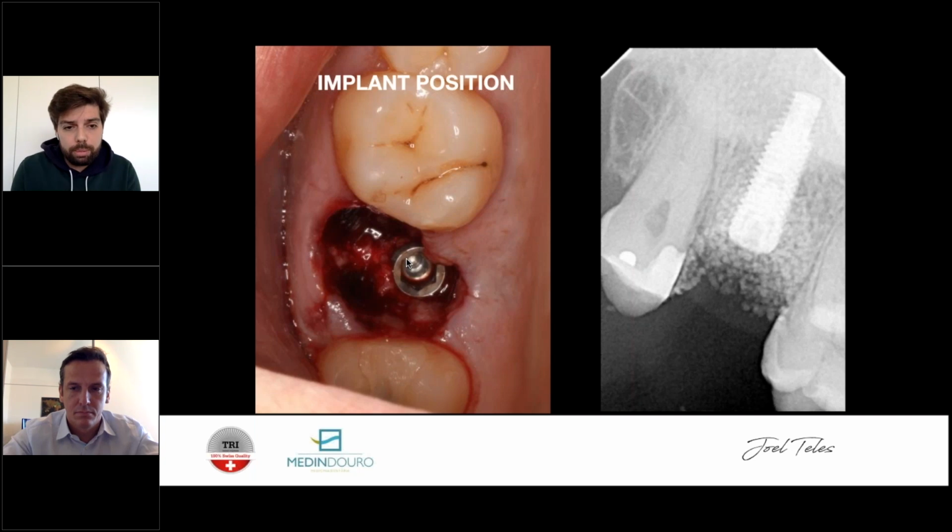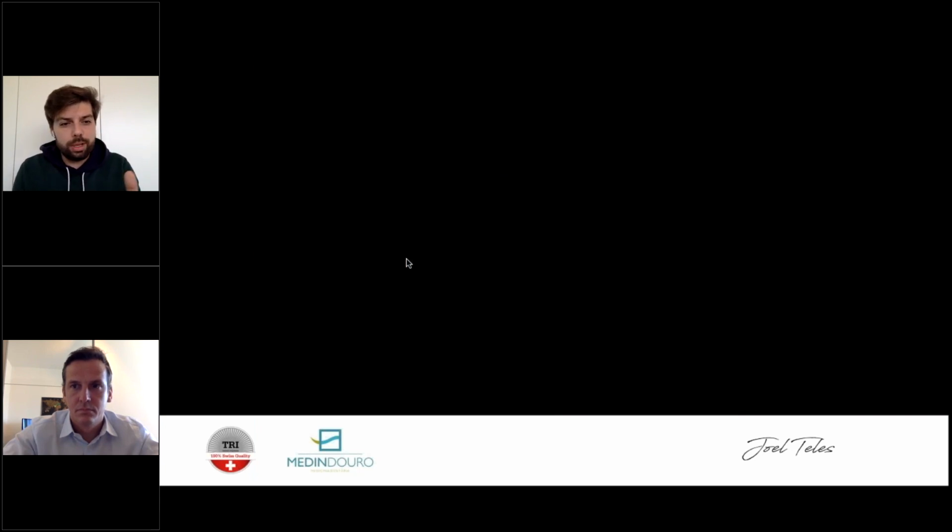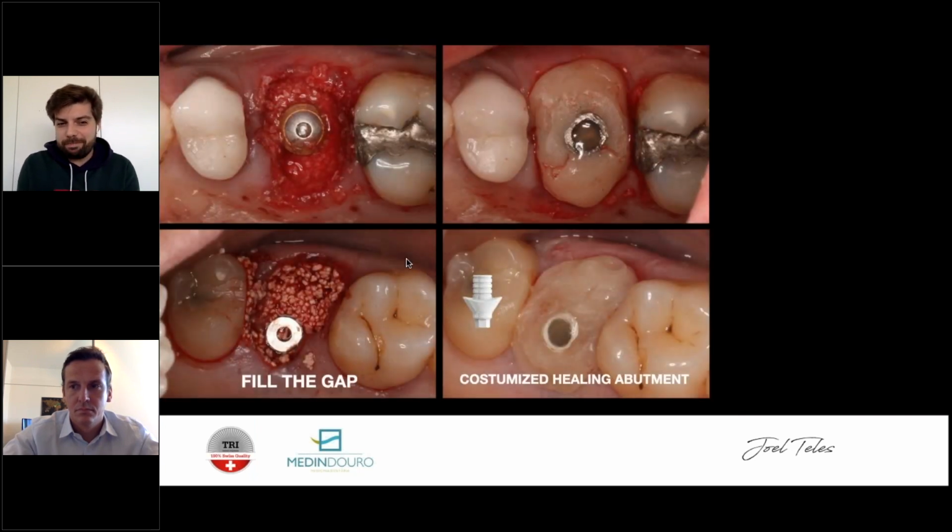Okay, so therefore I'm promoting more implant being in touch with the bone. I'm getting better primary stability, and in these situations, for me, that's why I don't do DTR all that often, drilling the roots. I like to see what I have, even though I have a clear image of what I'm going to get with a CT scan. I like to see it. And you waste drills doing DTR. In theory, you should use one for each case.